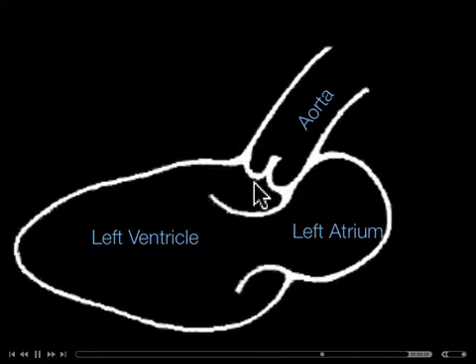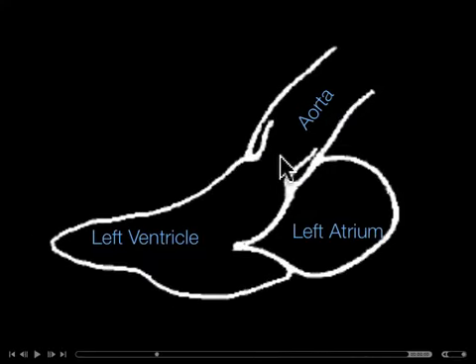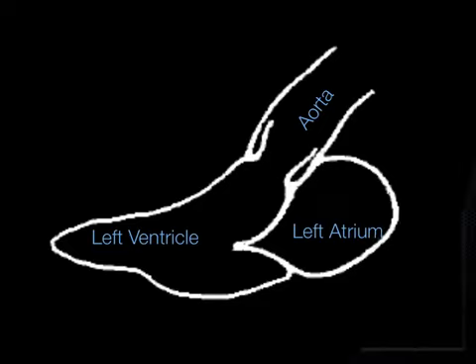I'm going to go ahead and pause it right there. And this is end systole. We can see that the heart is all nice and contracted down with the septum towards that posterior wall. At end systole, these valve leaflets fly open, and this distance right here is called LVOT, or left ventricular outflow tract, and that becomes a critical measurement when we want to measure the cardiac output.